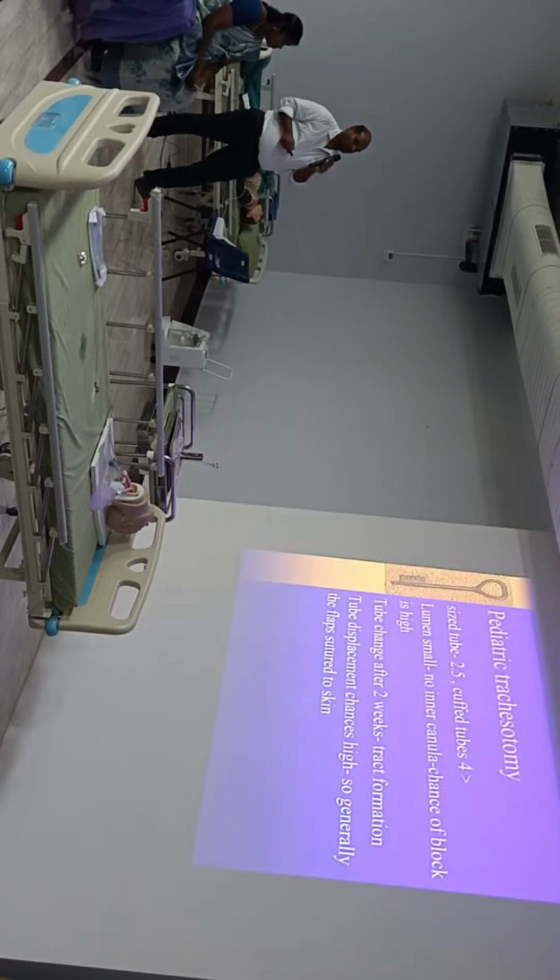In adult tracheostomies, we generally change the tube after 72 hours. But in pediatrics, the tract takes around 2 weeks to form. So when we want to change the tube in pediatrics, we generally change it after 2 weeks.